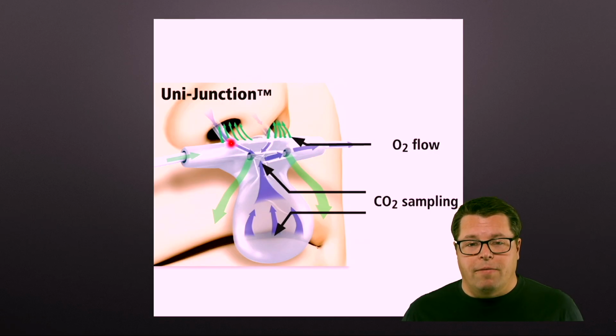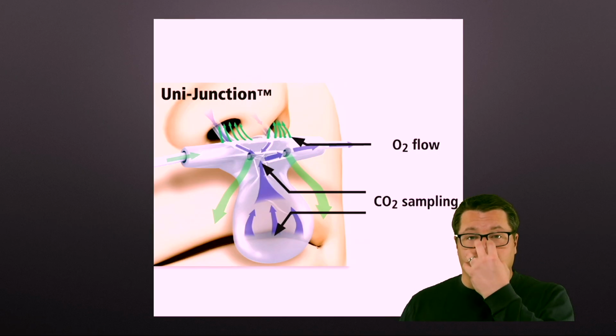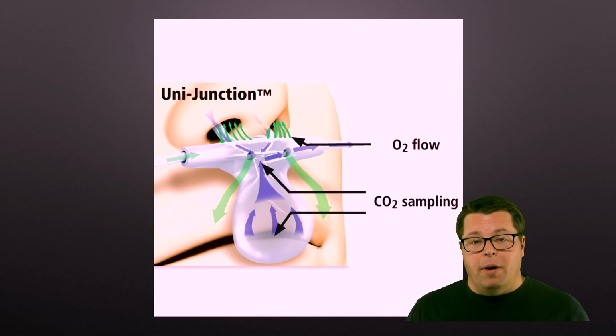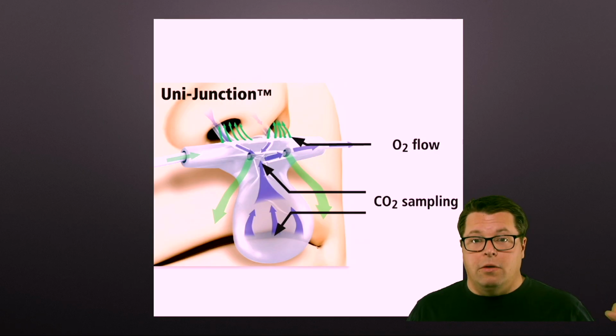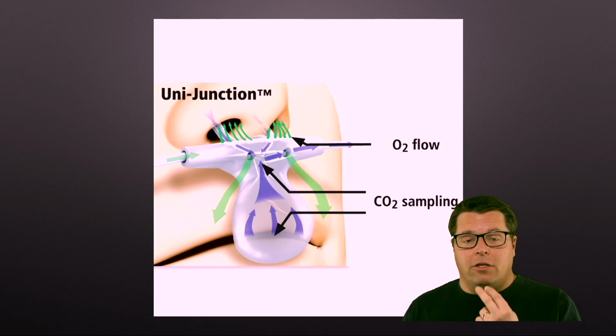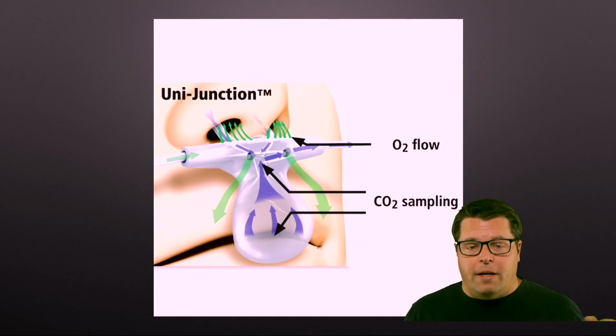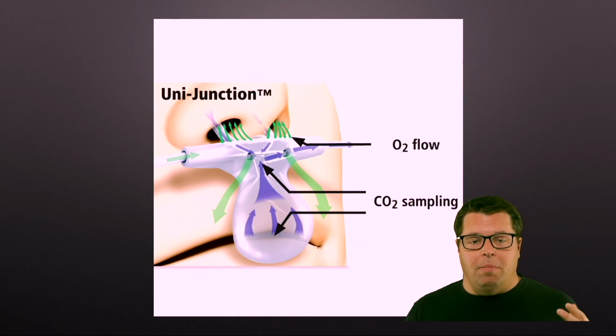If you look at the device itself, you'll see on this barrel that sits outside their nose, that is where you are actually delivering oxygen. The idea is it creates a pillow of oxygen on their face. But if you turn this up to flush rate, whatever will come out of the tank as fast as you can, then yeah, you're just blowing oxygen on their face. You will not actually get effective apneic oxygenation. You won't be able to augment what you might be doing otherwise.